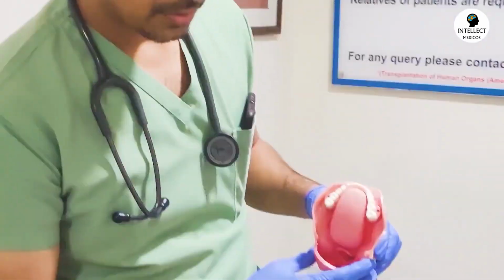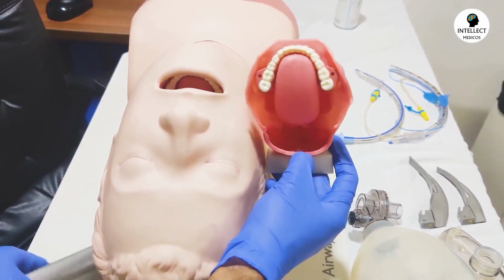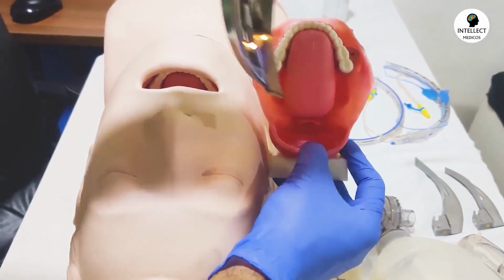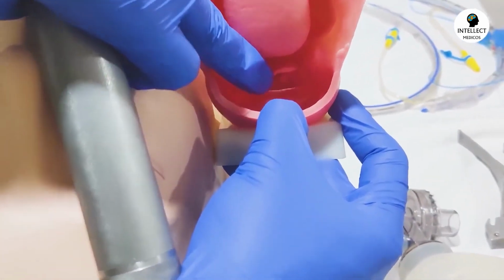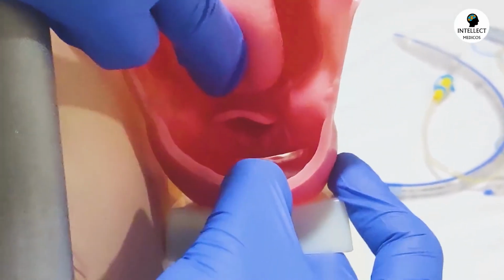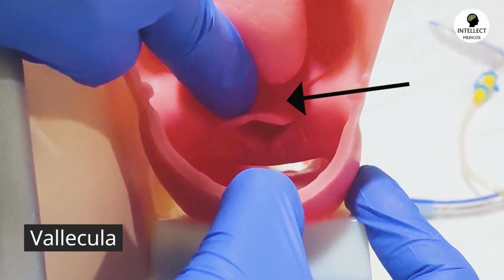Now I'll demonstrate you on this. This is the tongue. I will go like this. I will first of all deviate the tongue, and then when you see this epiglottis, can you see? This structure is called the epiglottis, and the space between the tongue and the epiglottis, this point, is called the vallecula.